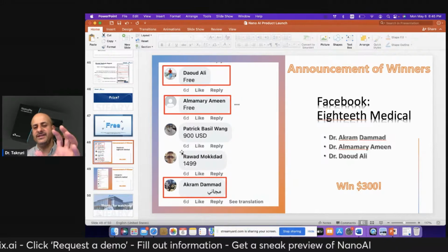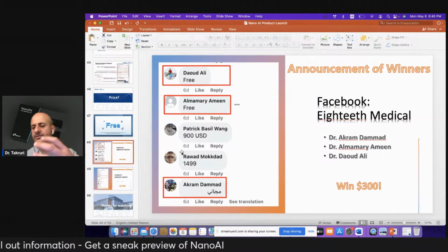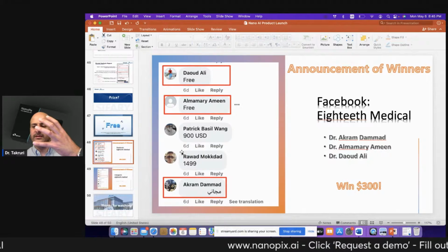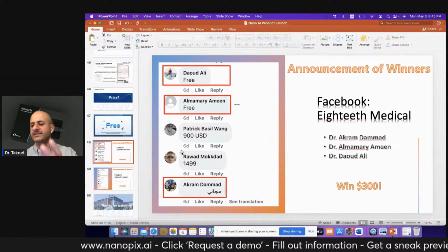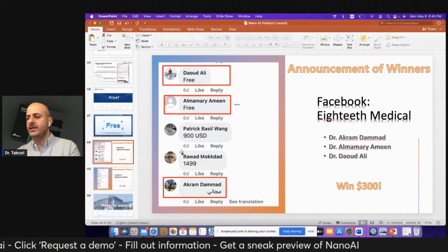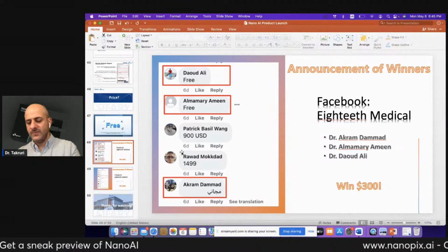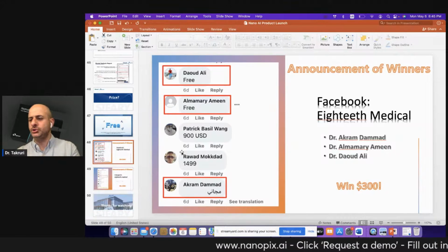AI is reading the canal depending on the intensity of the X-ray and the clarity of the X-ray. So if the canals are clear, the artificial intelligence will read them. But when you are giving information from a 2D X-ray, the AI will not give you an answer like CBCT, because the input is 2D.